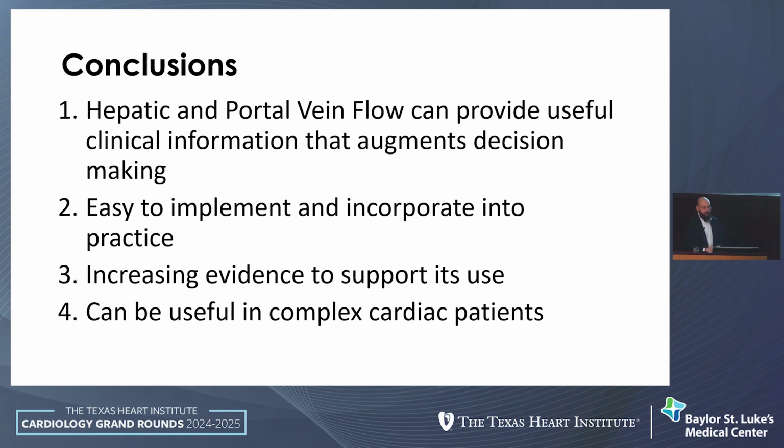With that being said, overall conclusions: these two aspects of visceral organ Doppler can help you a lot. It's easy to implement. I do a workshop for an hour, and after that hour, most of the people who do it are very proficient. And then within a few days of practice, they actually adopted it in their practice as well. I think as cardiologists, we're always very early adopters when it comes to new meds, when it comes to transcatheter devices, but we're very resistant when it comes to cheap alternatives and when it goes against what we've really been trained all our lives to do and what our forefathers have done.